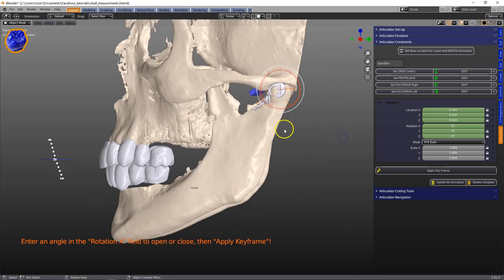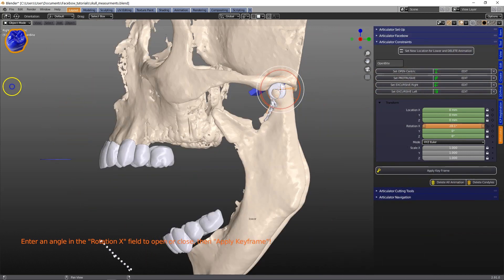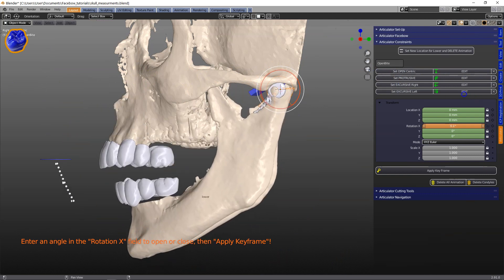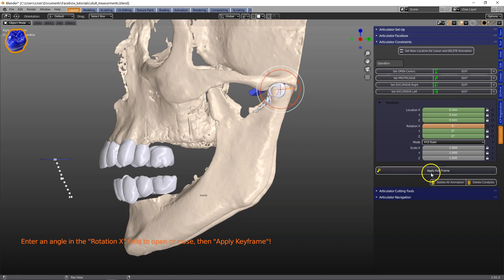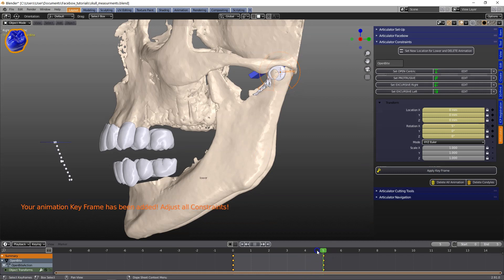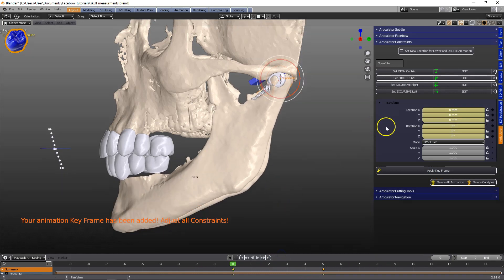Here we've got the open control. We can open by keying in or sliding the rotation X. Let's set this to 5 to 5 degrees — this is just an arbitrary value. If I open up the timeline we can see it move.